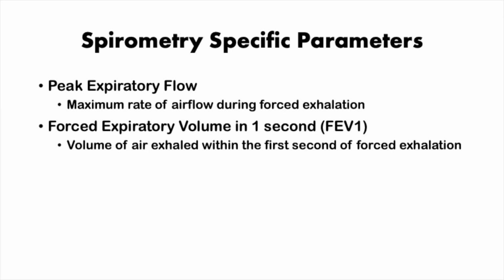Spirometry-specific parameters include the peak expiratory flow, which is the maximum rate of airflow during forced exhalation. And also forced expiratory volume in 1 second, or FEV1, is the volume of air exhaled within the first second of forced exhalation.